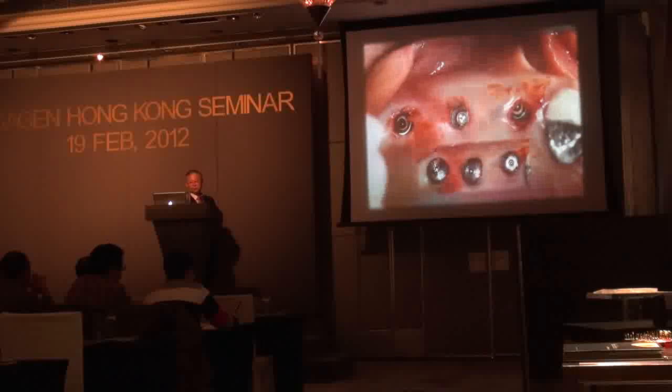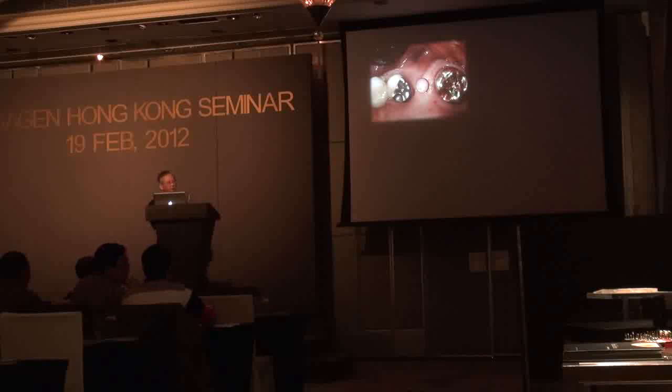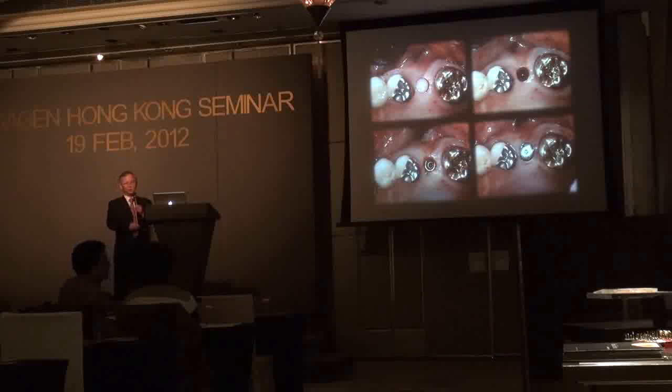Healing abutments, and on the opposite side, a single tooth missing. So I need the trephine again. Punch, trephine, the sequence, and healing abutments. It takes only 4 minutes. Four-minute operations without any complications, no pain, much less pain.